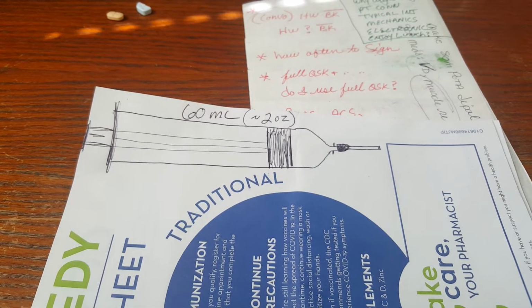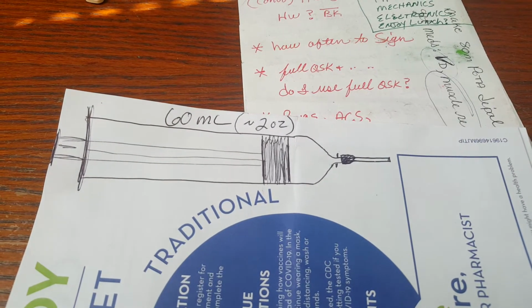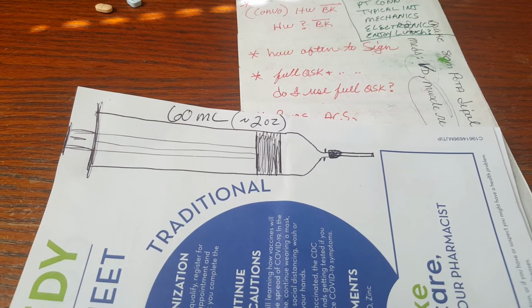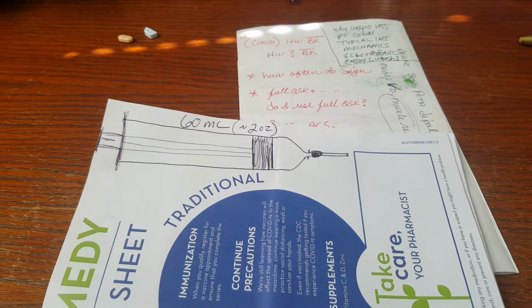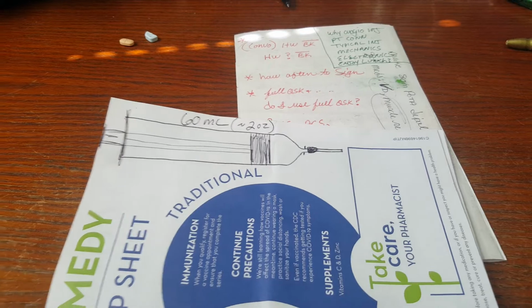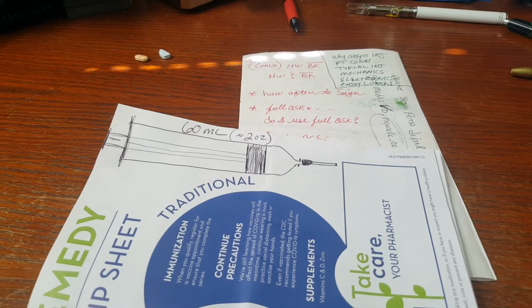And that thick, refrigerated substance, you clamp that syringe into the angio injector, you vacate the area lest there is an explosion from the pressure, and from the control booth they initiate the injection while the patient lays under a fluoroscope so that they can watch the contrast media flow through his circulatory system.